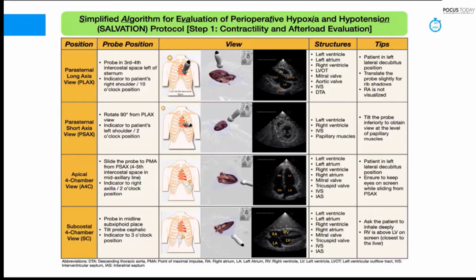These are standard POCUS cardiac views, and we have covered them in separate video tutorials in the past. Nevertheless, we will go through them once again to give you a brief overview. A standard phased array cardiac probe with a small footprint is used to obtain these views. Let's go through the cardiac views first.